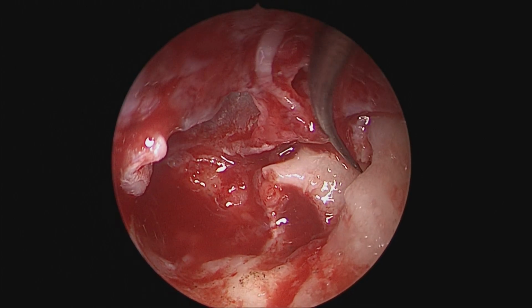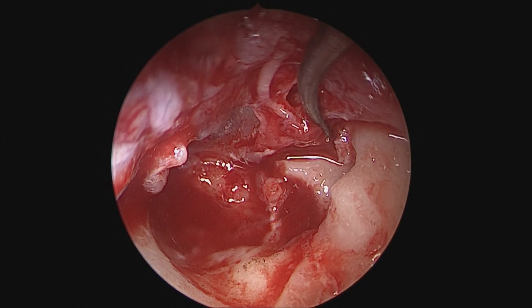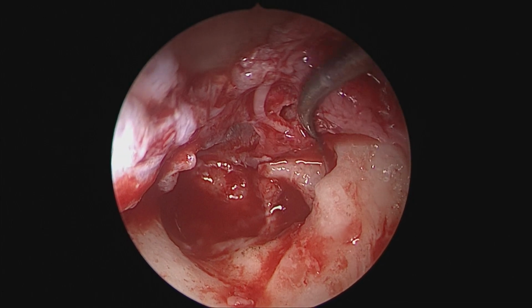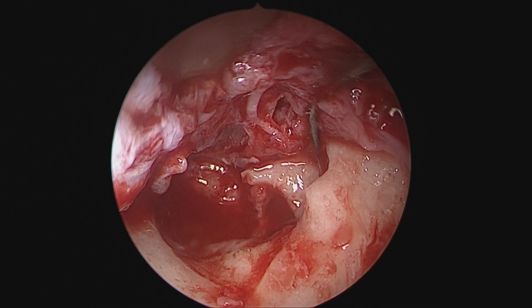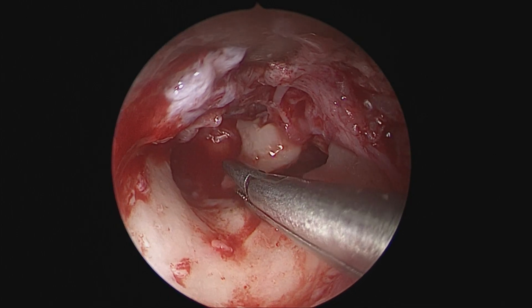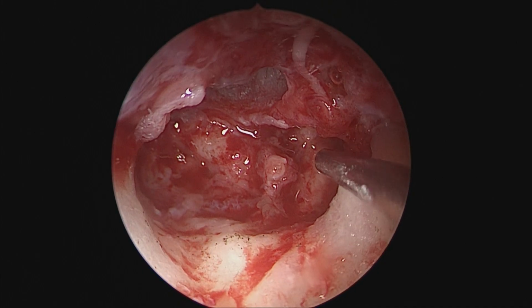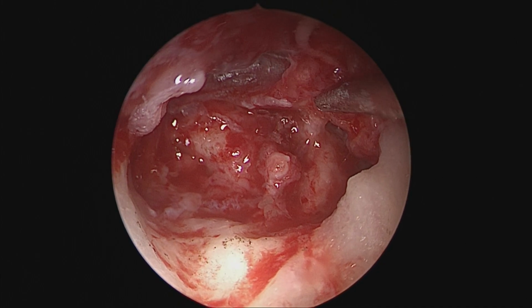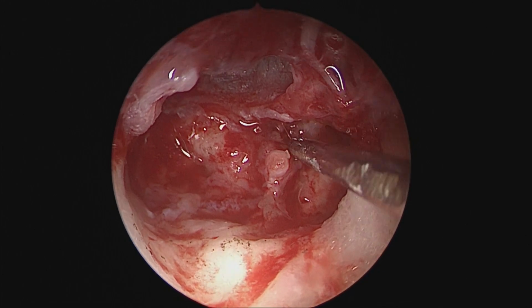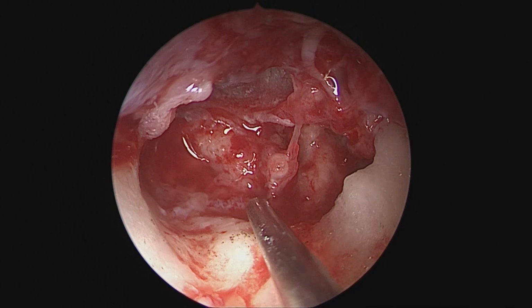So we use a curved needle or a curved pick to very slowly mobilize the incus from its bed, to pull it downwards slowly, and again trying to not use any strong force because that could dislocate the stapes. Once the incus is free, we remove it. Since this is a patient who had active Pseudomonas infection, we would not be using the autologous incus in this situation. We would be only using the cartilage directly on the stapes head for reconstruction.